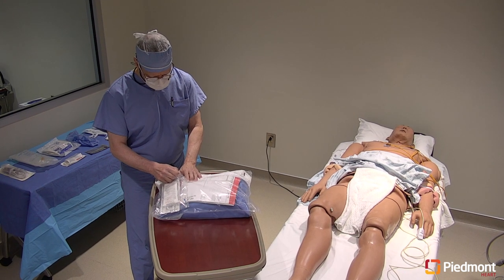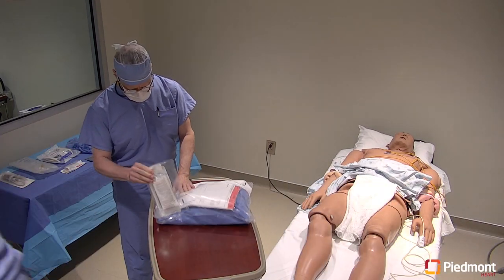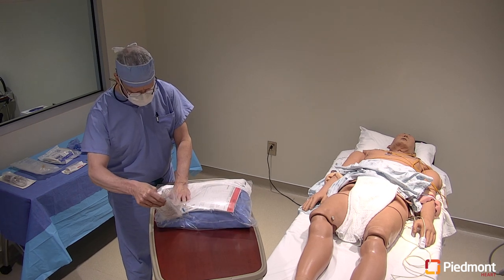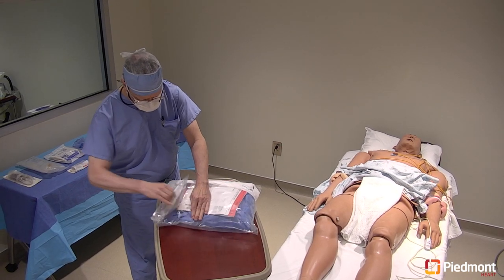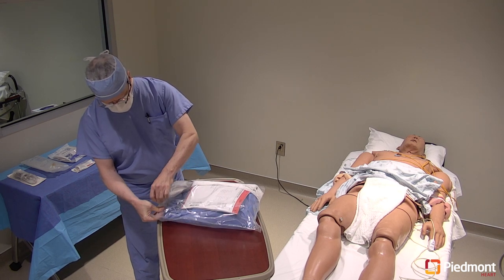Remember that once the physician begins creating the sterile field, you and anyone else in the room must don bonnet and mask to maintain sterility.